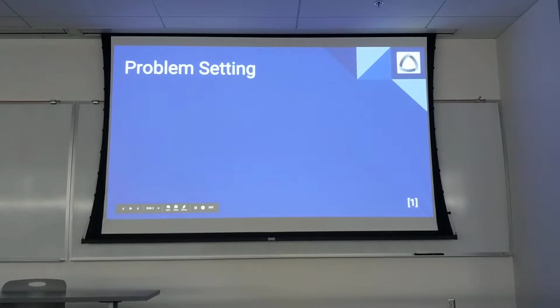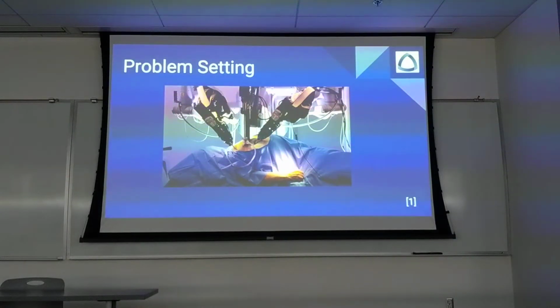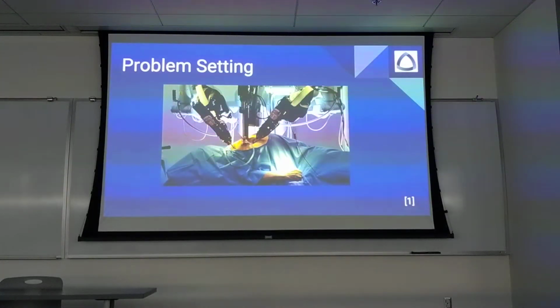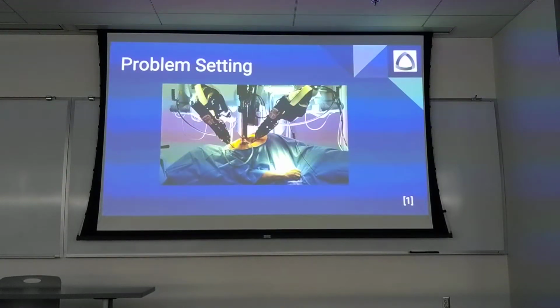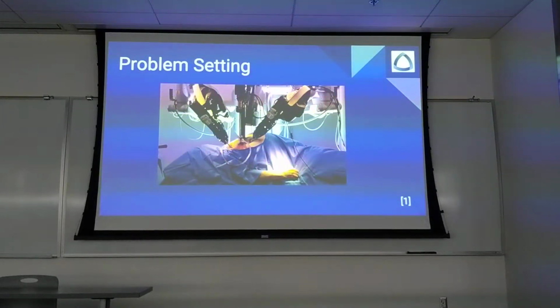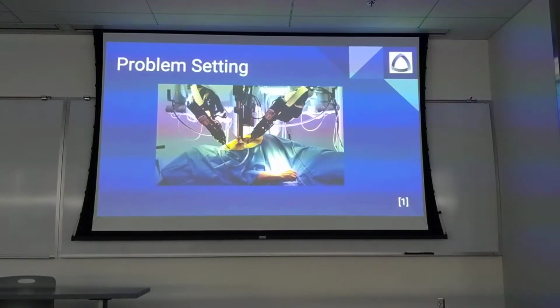Surgery is an extremely important practice that requires careful control of both the tools and instruments in order to perform operations without harming the patient. Remote surgery, otherwise known as telesurgery, is when a surgeon is not physically present while operating on the patient. The surgeon manipulates a robot at a distance in order to perform the surgery. When performing these operations by hand, human errors can lead to fatal mistakes, and surgeries can become safer with robotic aid.